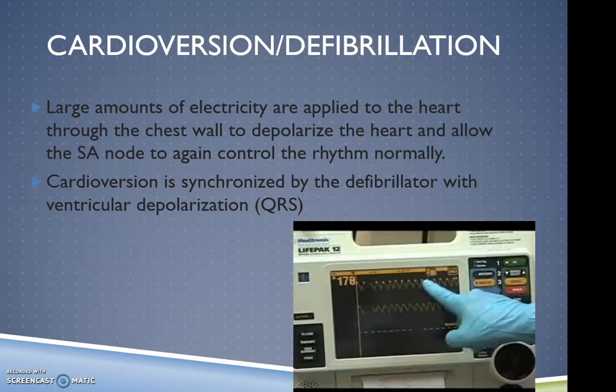The difference is cardioversion is synchronized by the device with ventricular depolarization, the QRS complex. Defibrillation is asynchronized. There is no need to synchronize it because when we use defibrillation, there is no organized rhythm to synchronize it with.